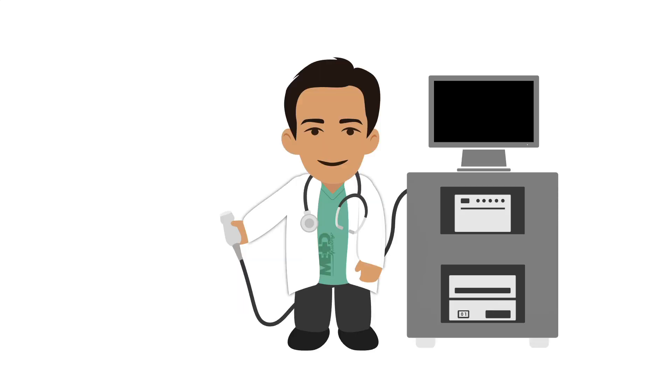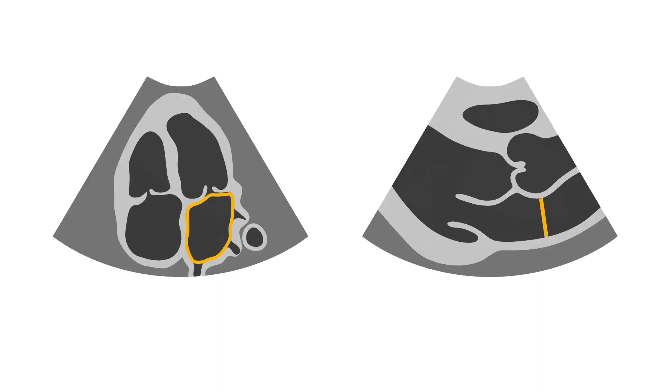Let's first review how you measure the left atrium on 2D echo. Here you can see the left atrium being measured. A normal left atrial area is less than 20 cm2, and a normal anterior-posterior diameter ranges from 2 to 4 cm.